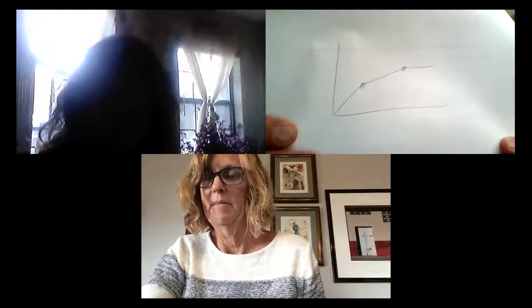Linear gain, and then you're going to see a little bit of a knee point here with WDRC, and then from here a second knee point. And then I'll draw it for you just to tease you, because I like teasing OTC people. Your input-output function is going to look like this. So linear gain is on the left, WDRC is between the 2 knee points, and output limiting is to the right of the second knee point. Cool. So just thought I'd tell you that. True stuff.